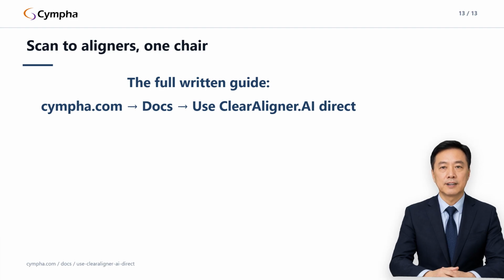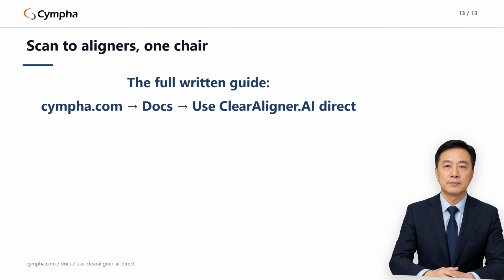15 minutes for your first case. And the free first look means trying costs you nothing but the scan you already have. If you later want the lab-routed version of the same engine, the AlignerBot submission lecture covers it, and the approval lecture goes deeper on the approval page both flows share.